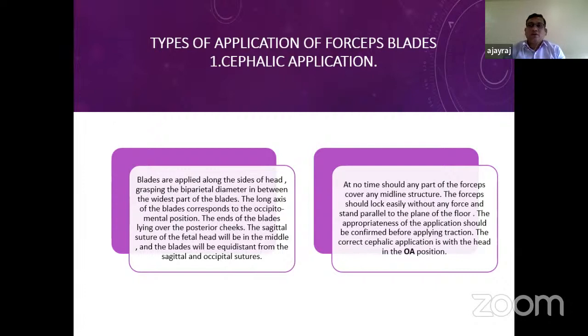Another confirmatory test that forceps are applied properly is that the forceps should lock easily without any force and stand parallel to the plane of the floor. The appropriateness of the application should be confirmed before applying traction. The correct cephalic application is with the head in the occiput anterior position.